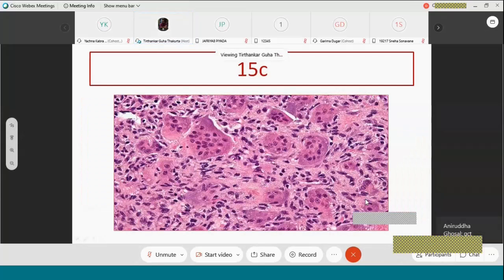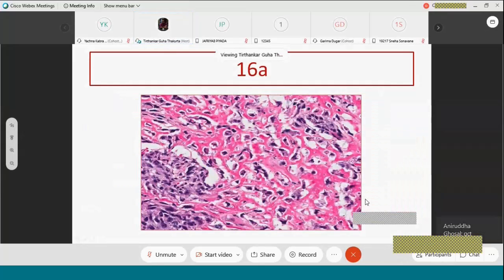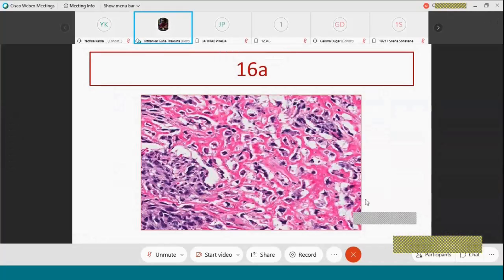Identify this tumor. There is a pink lace-like matrix, and within the gaps of the lace, there are multiple cells that are embedded, hyperchromatic cells embedded. Again, you are saying amyloid. Amyloid is not in the syllabus. It could be amyloid. Technically, you are not wrong, but it is not in the syllabus.